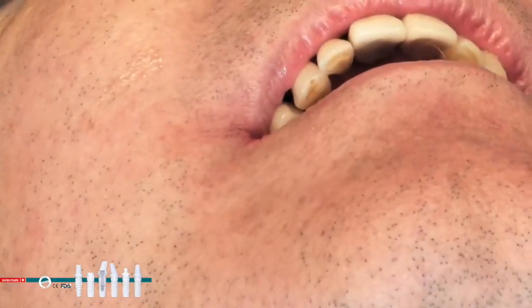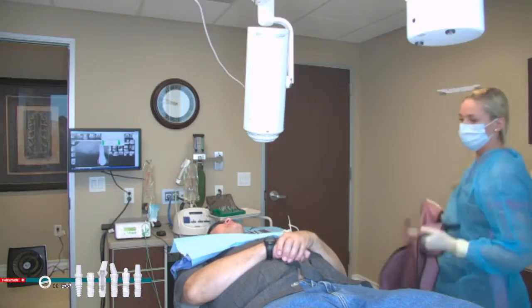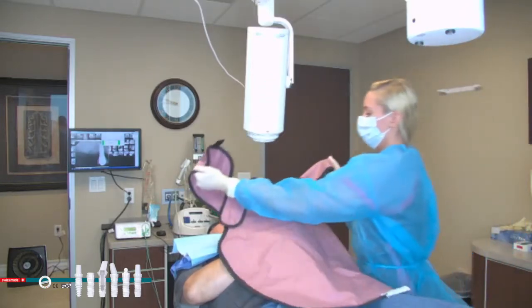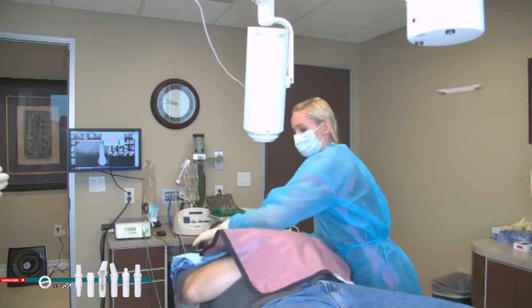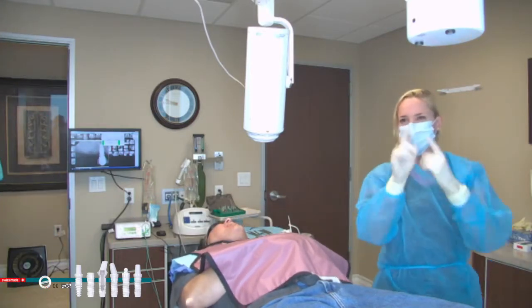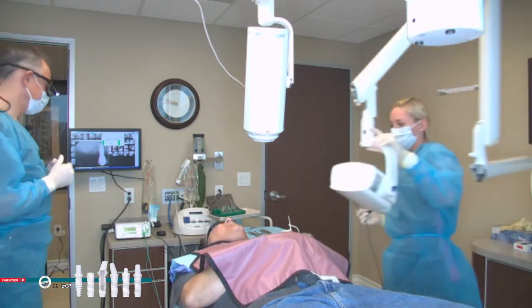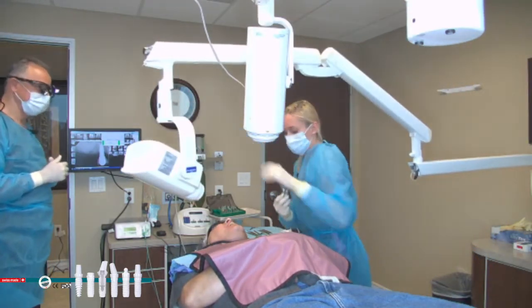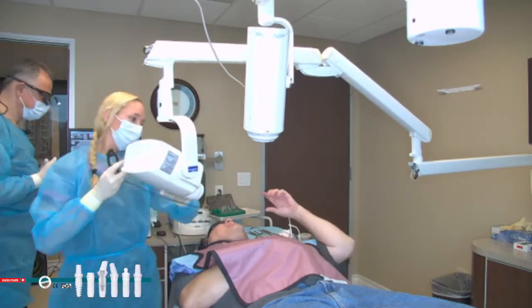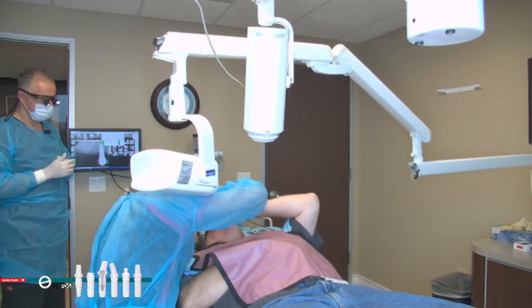Perfect. All right, Mark, so we have that guide put in there, and I'm going to go ahead and take a picture of it like I was telling you. Any questions coming through? Place this over you. We're all talking to each other. These assistants are helping too. I'm going to take the x-ray. Go ahead. Okay, Mark, I'm going to have you bring your left hand up once more. Go ahead and open. Right there.